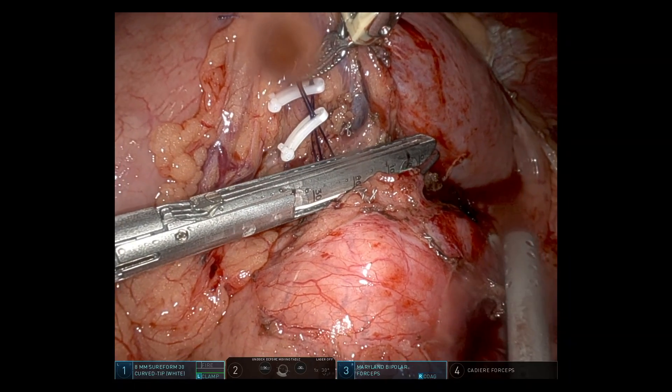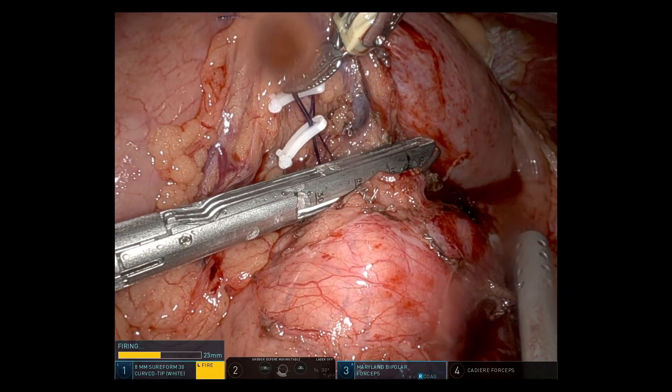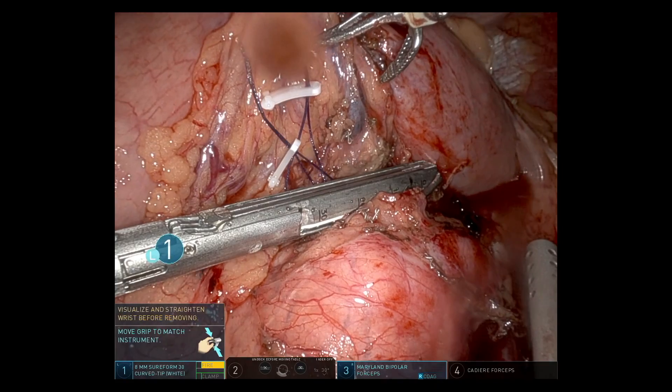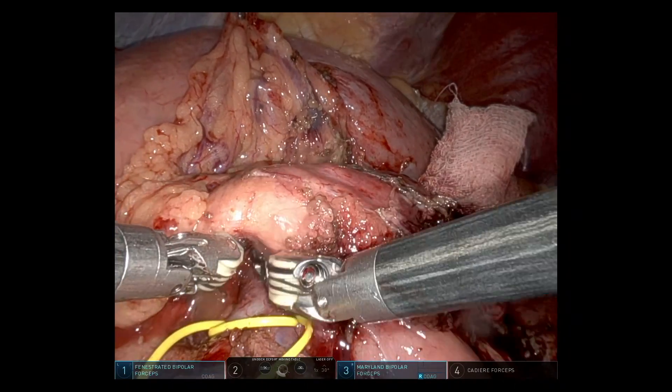With control established, before doing anything further with the splenic vein I'm going to divide the splenic artery. After stapling, I applied a Hemolock clip to the proximal side.